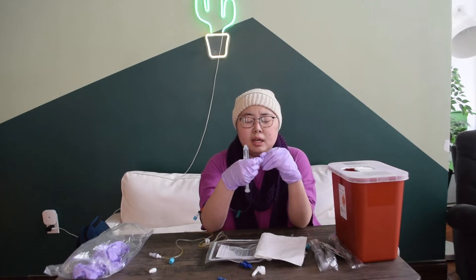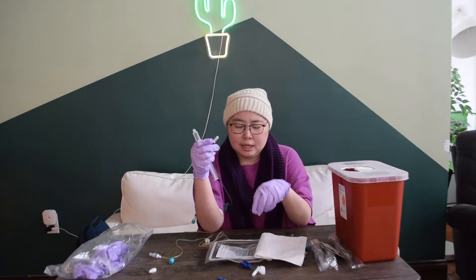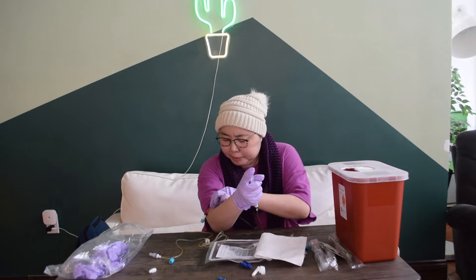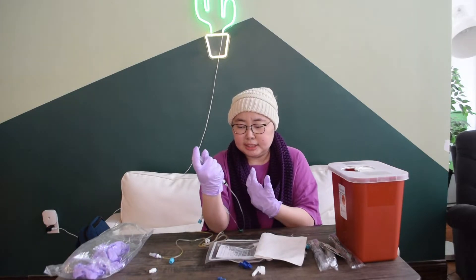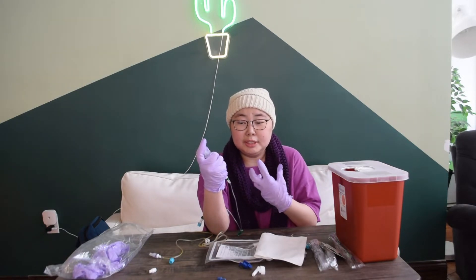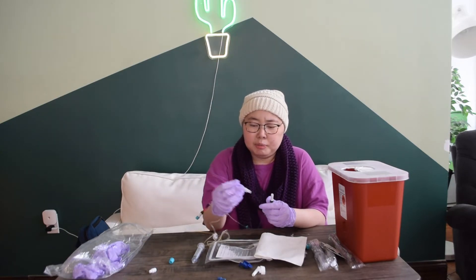I'm all for being clean. I'm a little shaky — I'm still on a lot of steroids, so it makes me a little extra. To flush the line first, you just screw it on, unclip your clips, and push. This is the weirdest feeling ever — I'm pushing liquid inside my arm and I can feel the cold in the tubing. Sometimes nurses will push it really hard and almost make your heart jolt, so I don't push that hard. But you can feel it sometimes. So flush it — which is good — and then I'll put the magnesium on.